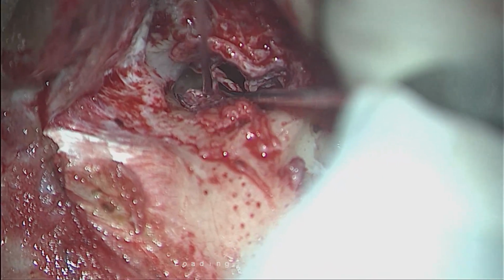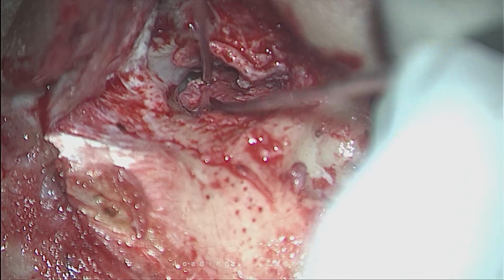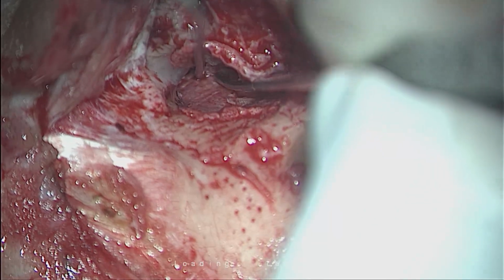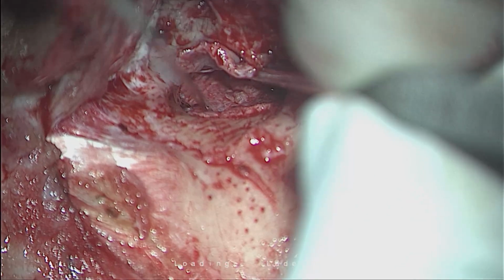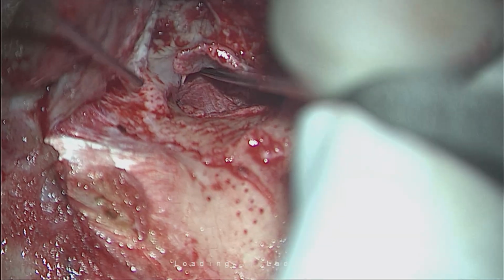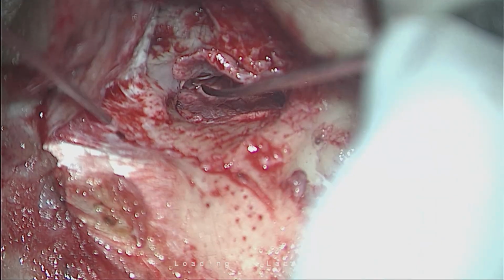The first part, I explain to our junior colleagues, is this grafting in 3 phases. Number 1, what I am doing is introduction of the graft all the way in the middle anteriorly. See this? This is simple introduction.